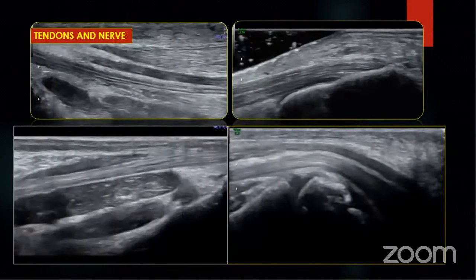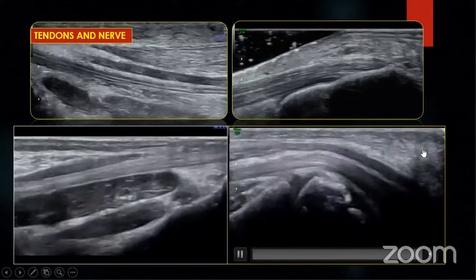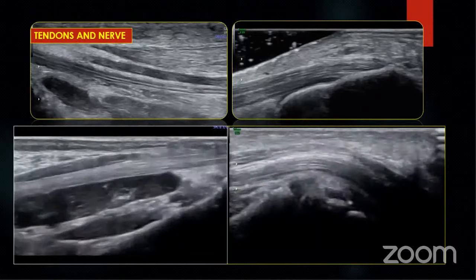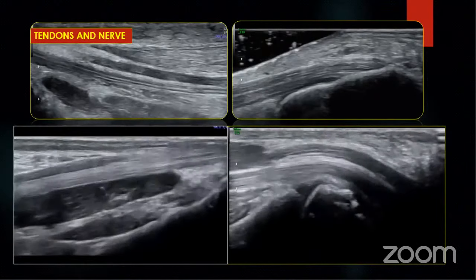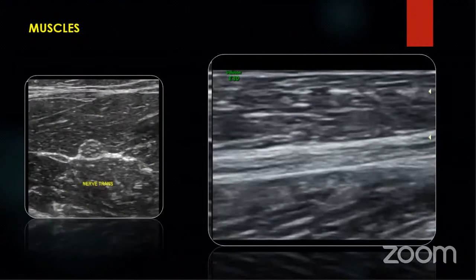A tendon usually lies close to a joint, and a tendon always shows a very compact, increased echogenicity, and it shows free mobility with the movement, unlike a nerve. And the nerve usually moves between the muscles, and muscle has a typical pinnate appearance here, and it is easily identifiable from the nerve. And on the cross-section muscle shows a typical starry sky pattern, and you can identify the nerve lying with a typical honeycomb pattern there. So going to the nerve pathologies.